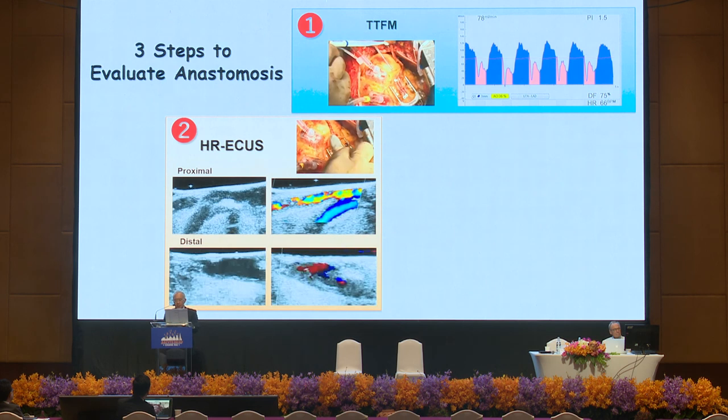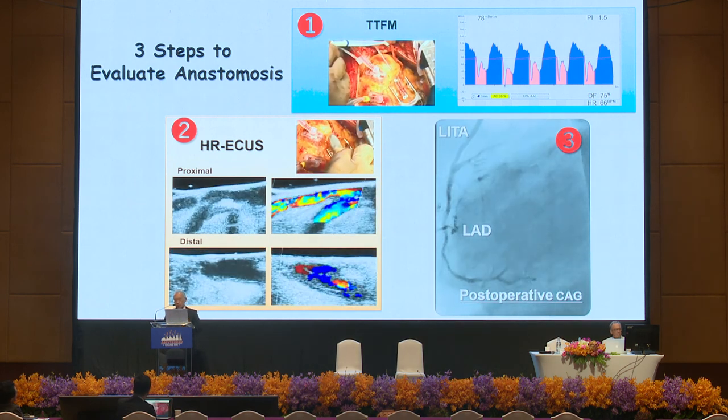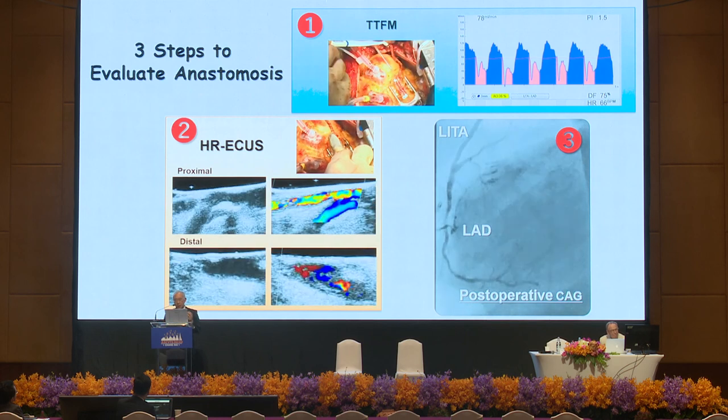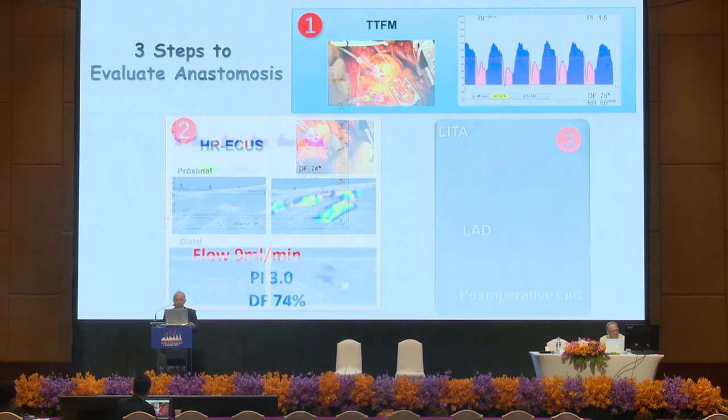And finally, before the discharge, we perform a postoperative CAG, and it shows not only distally but also proximally, the graft is satisfactorily perfusing all the LAD areas.